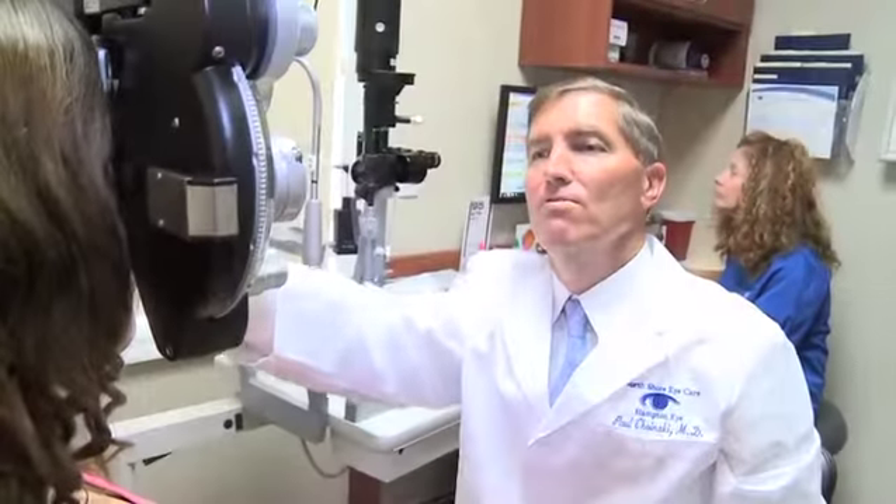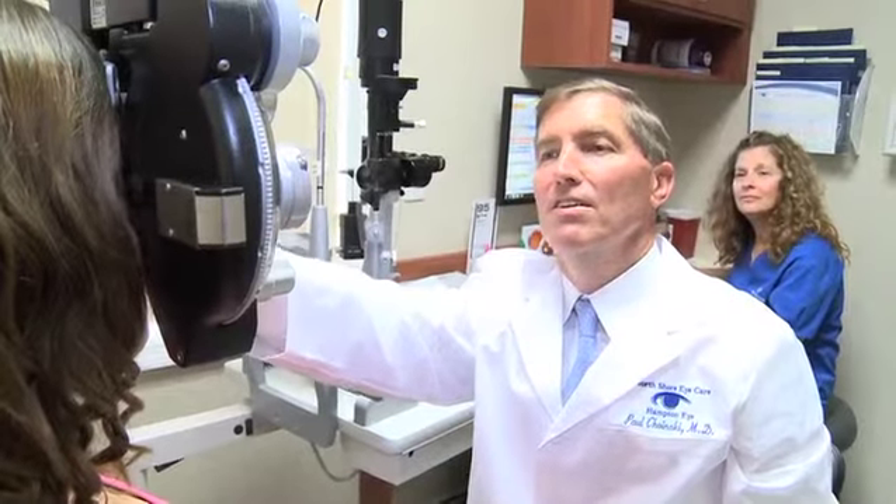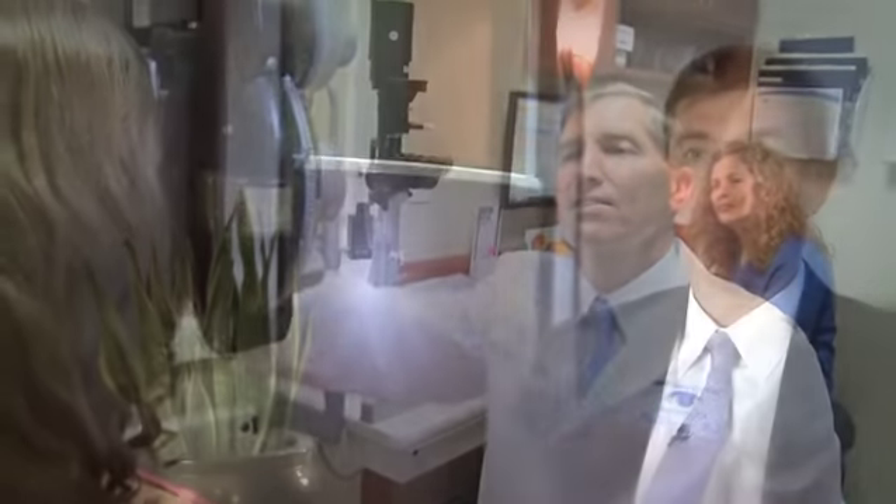On the day of cataract surgery, patients arrive and the first thing that happens is they have lots of eye drops put in to dilate the pupils and get them prepared for surgery. An IV is then started in the patient's hand so that sedation can be given during the surgery to relax the patient.